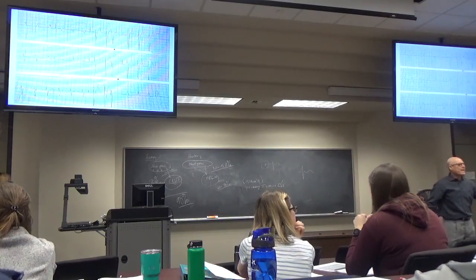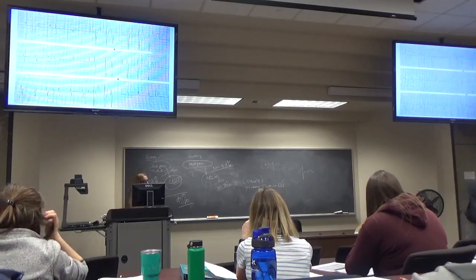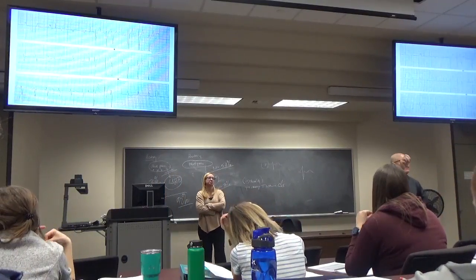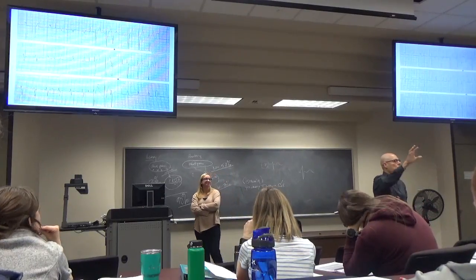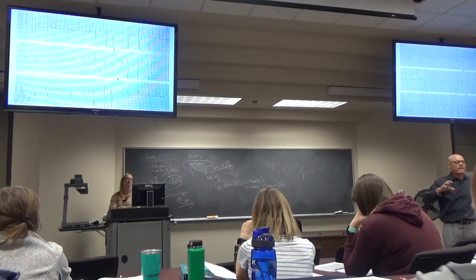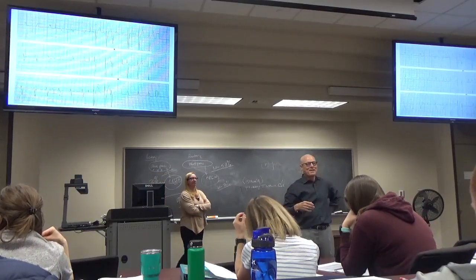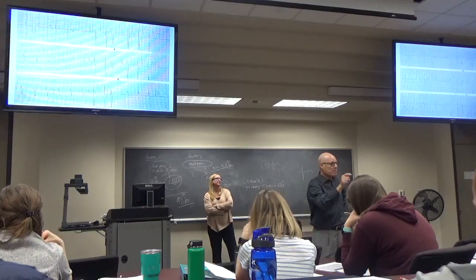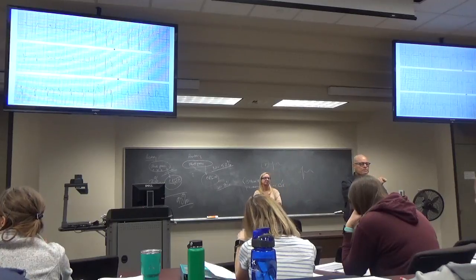So you'll never be asked, what is the PR? You're never asked that. It's in the conclusions. All I'm doing on the EKG exam is seeing if you can get the conclusions. What group of findings on this EKG are most likely? So you don't have to be exact, unless it's first degree AV block, then you've got to be exact enough. If first degree AV block is one of the answers, you better go back and look really carefully at the PR interval.